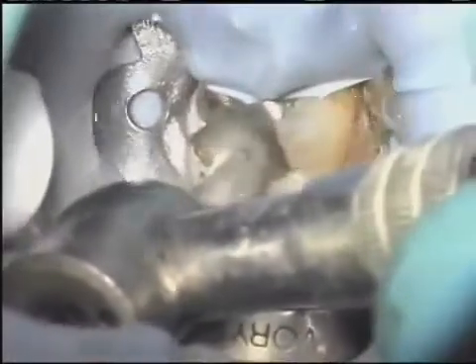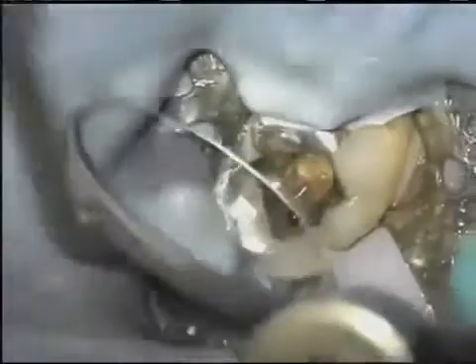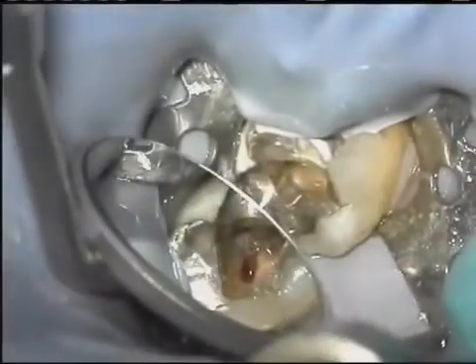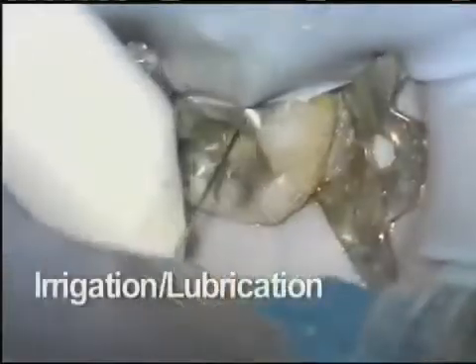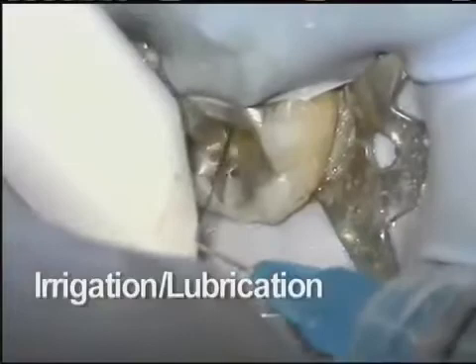With the ProTaper Universal system, as with any instrument system, a good outcome begins with good access. We've edited the procedure to focus on just the key points of the technique. In this clinical example of a lower molar, we'll be focusing on the mesial lingual canal. All of the other canals are prepared in the same manner. Once a straight line access has been established, thoroughly irrigate and lubricate the space. This is recommended after every rotary file.